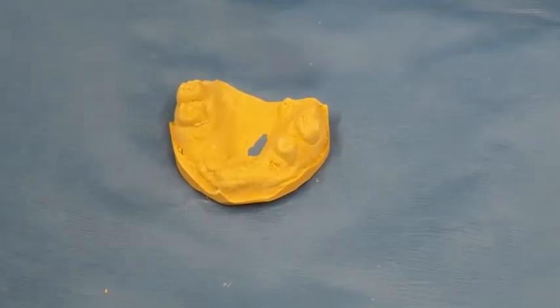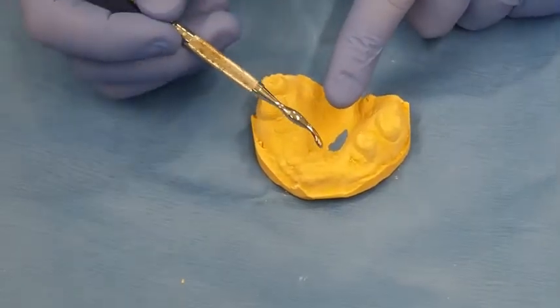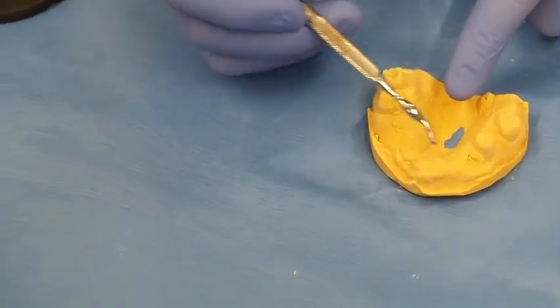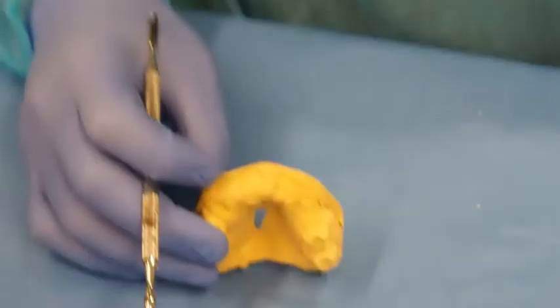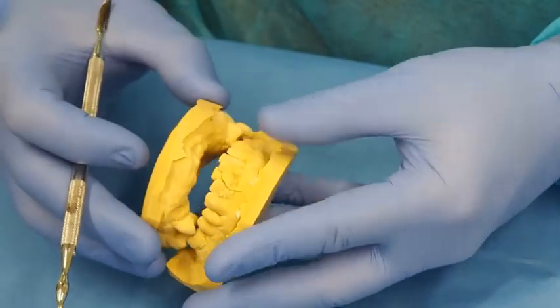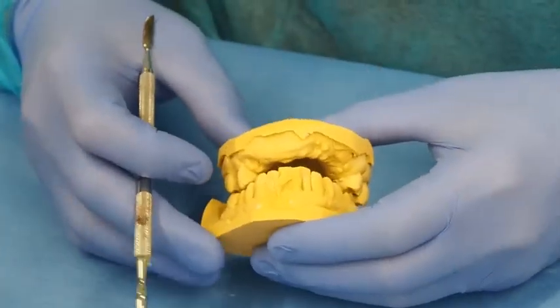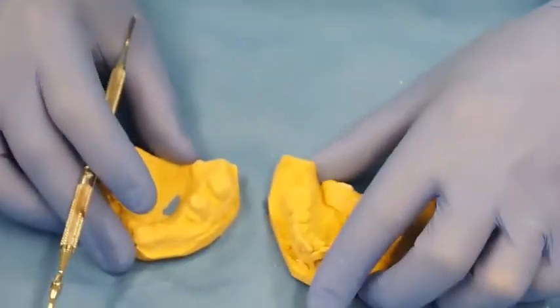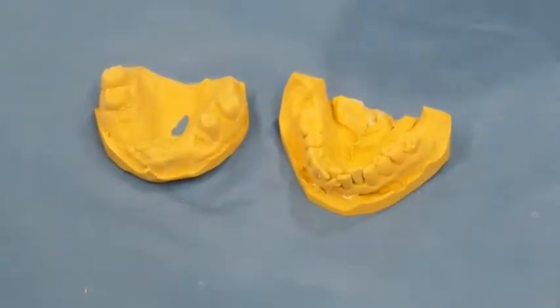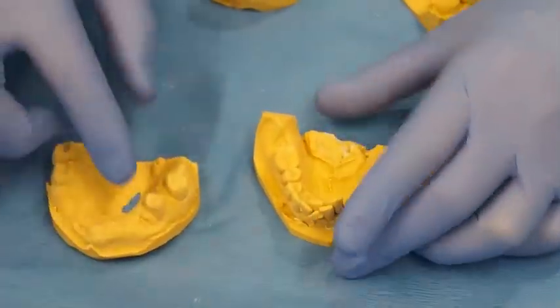You can't have all of them because they haven't been extracted yet. They won't go in the mouth. In this case, I can do an aesthetic try-in, right? Because it would not interfere with the treatment. It might not even be the same patient for that matter. Anyways, I wanted to show you, so this is a very straightforward case.